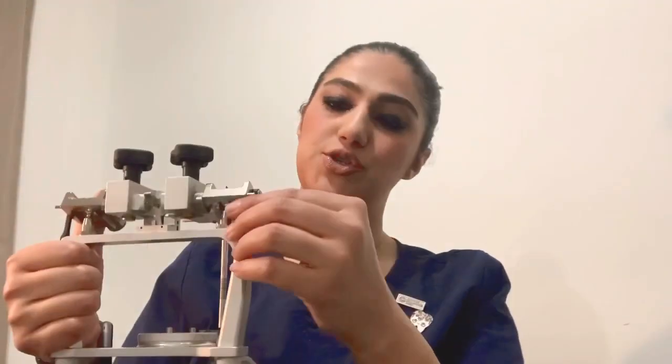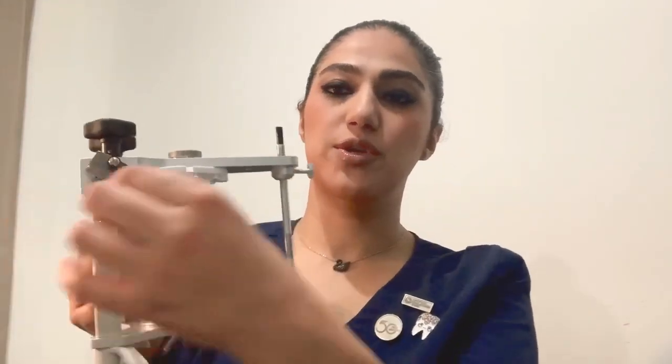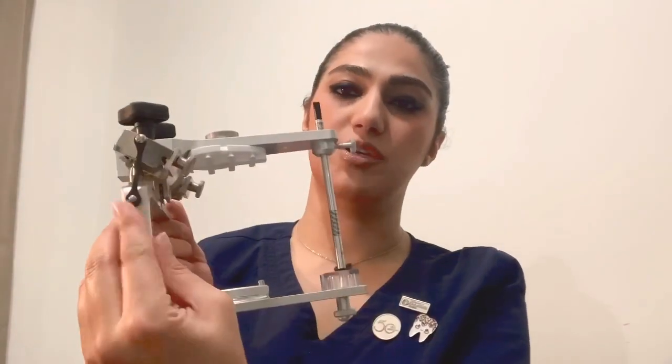There are two rubber bands here. These rubber bands are attached to the two components of the articulator, and the lower part is a simulation of the temporomandibular joint ligaments.